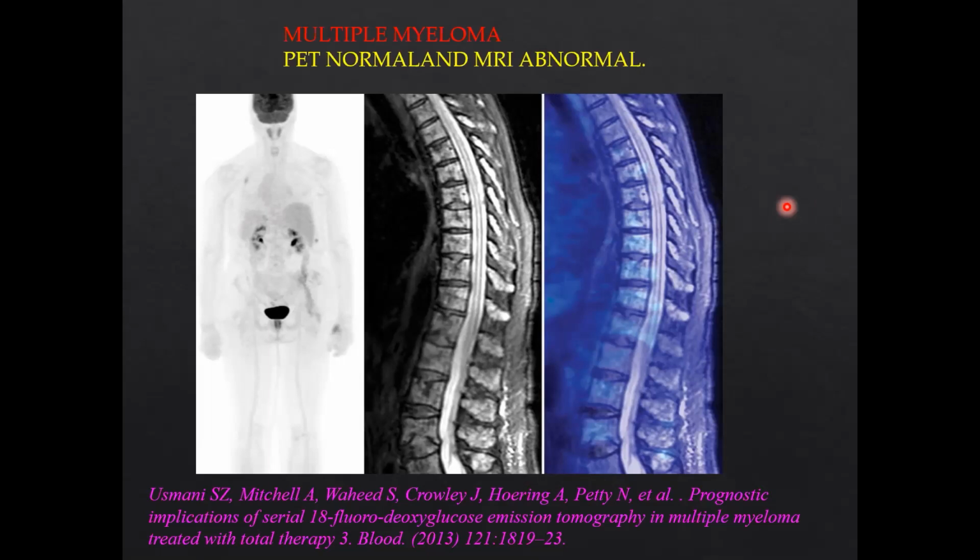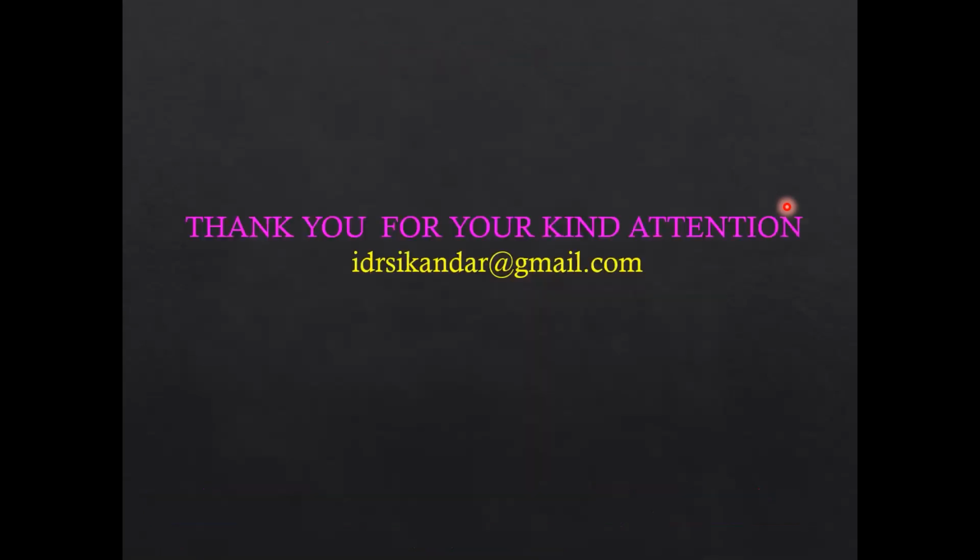But the blend of PET and MR imaging modalities will be the best combination to come in future, and it will overcome the role of PET CT, especially in relation to all soft tissue components. The only gray area for PET MR will be bony evaluation. So with this, I hope I have covered everything, and I am thankful to all of you for giving this kind attention.